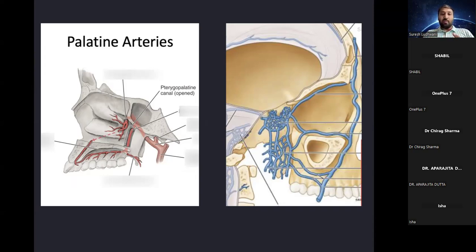Now, the pterygoid plates are two, the medial and the lateral. Most of the literature says that you are supposed to engage the medial part of the pterygoid plate, but I am not convinced by it. I will explain why. And the vital structures which we need to remember are the greater palatine foramen canal, the lesser palatine, and the pterygopalatine canal, which has the pterygoid plexus nearby.